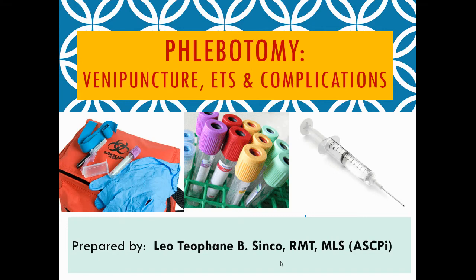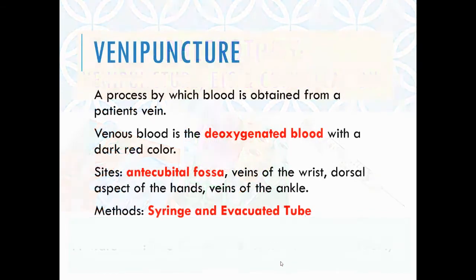So good day everyone. For today we'll be discussing phlebotomy, venipuncture, ETS, and complications. First things first, we will be talking about venipuncture. And venipuncture is a process by which the blood is obtained from the vein of the patient.